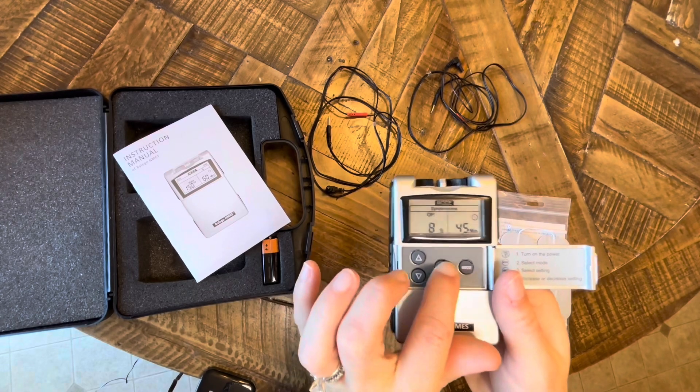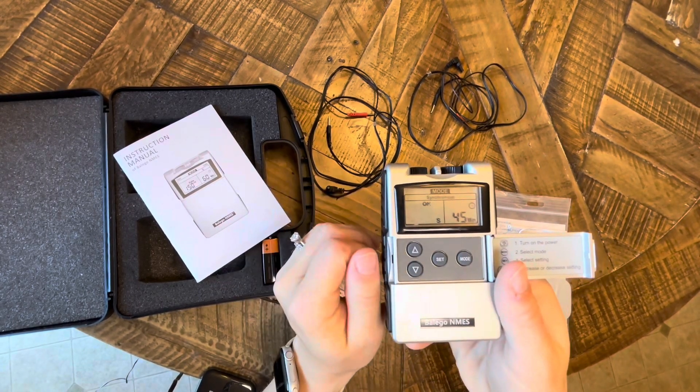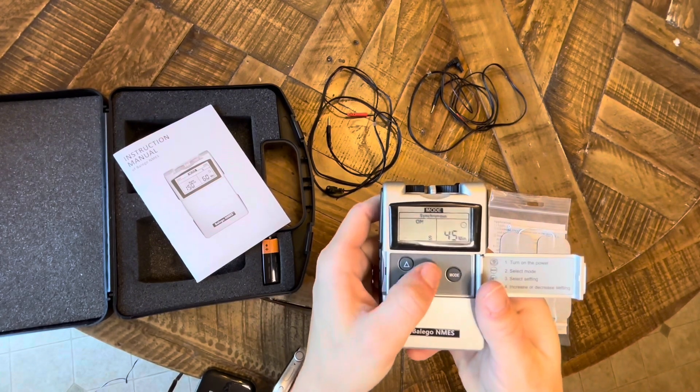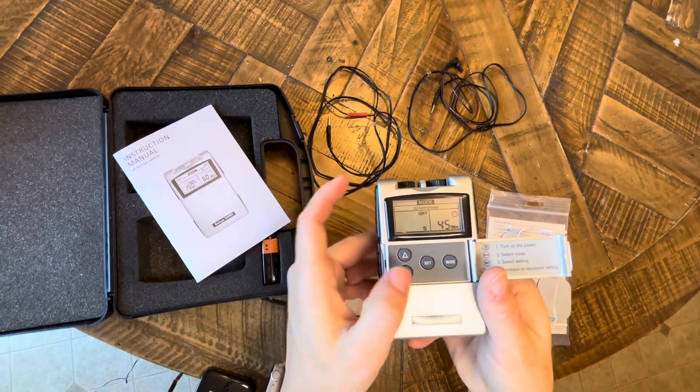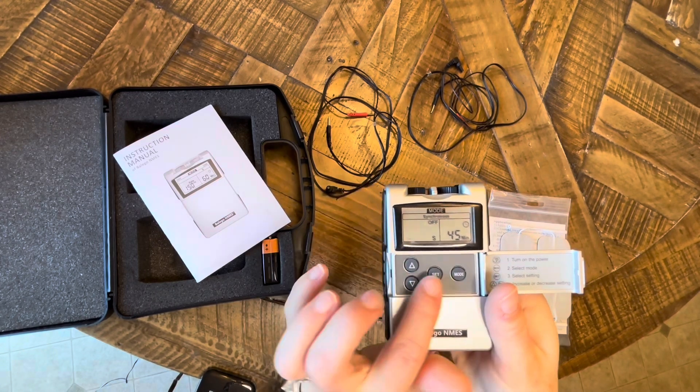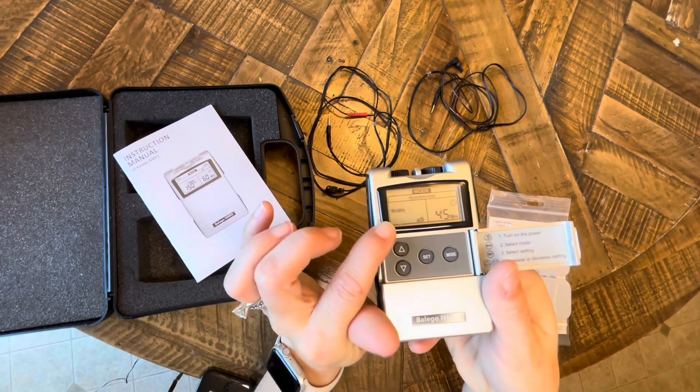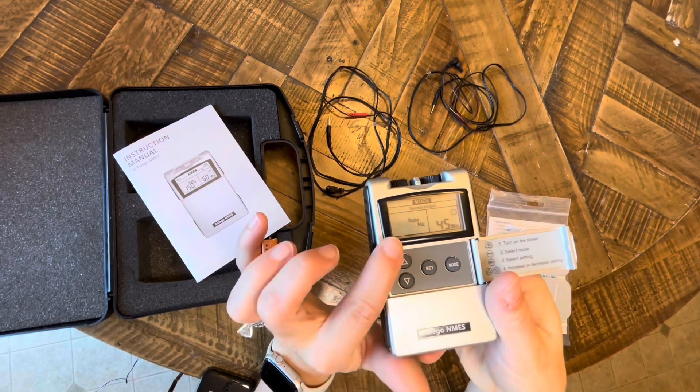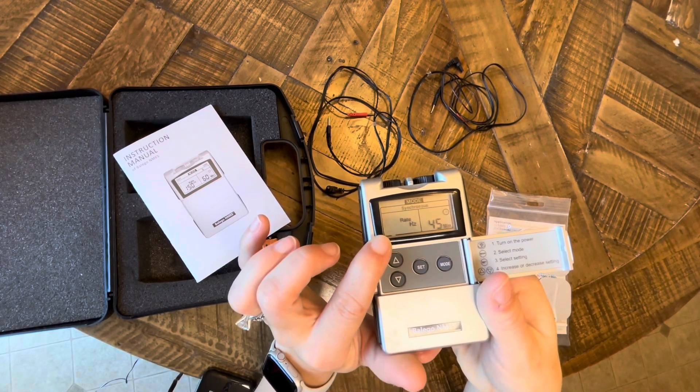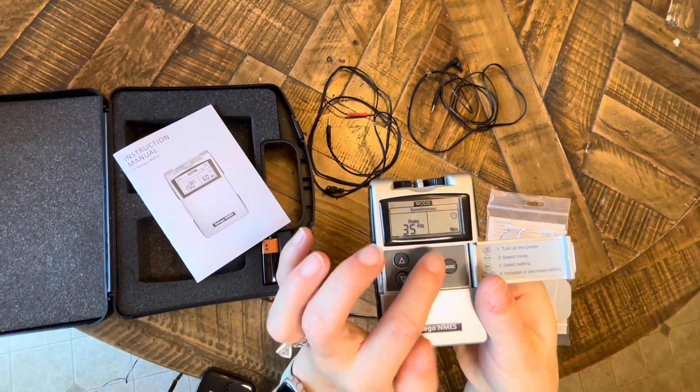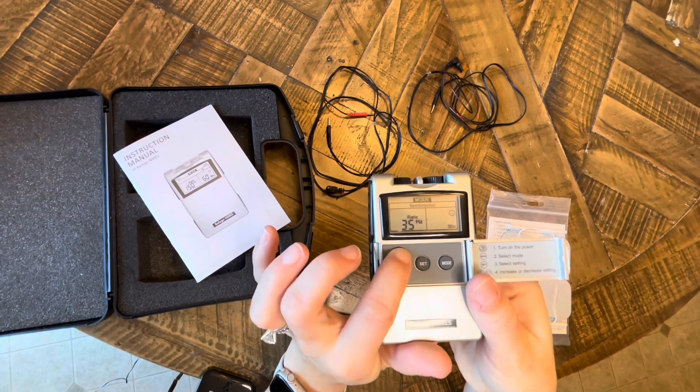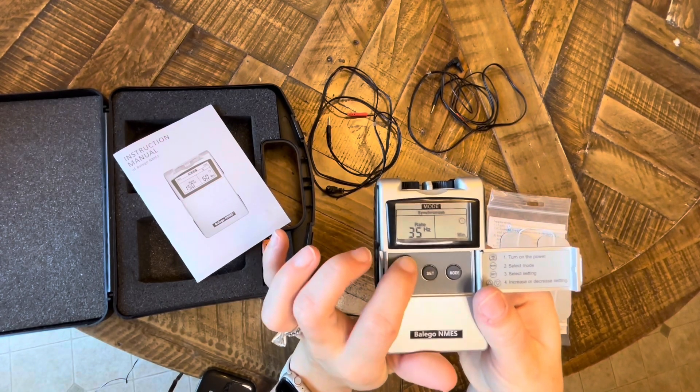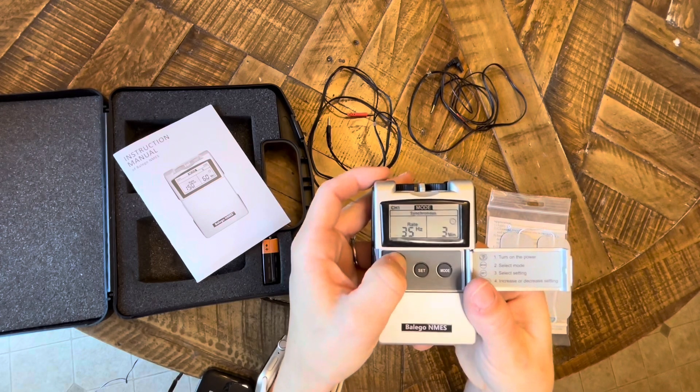And then you go ahead and you press set and that's going to change your ramp, on, off, and then your pulse width and rate. So you choose what you want. If I'm using this for functional e-stim, so I'm combining it with a task, I will do my on/off typically five seconds on, five seconds off, with one second ramp.